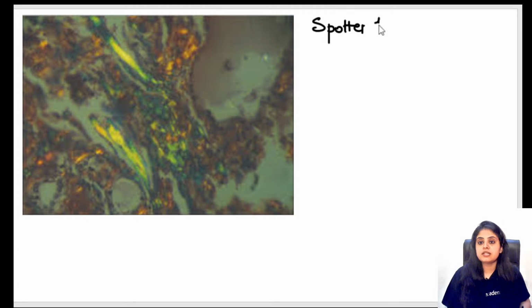So everyone needs to type out whatever you feel the answer is. And I'll be giving you like 10 to 15 seconds to think before I spill the beans and tell you the answer. Okay, so I can see the first answer coming my way, and I hope everyone will agree with this. Yes, this is a classical and a must-know image in pathology, that is from amyloid.